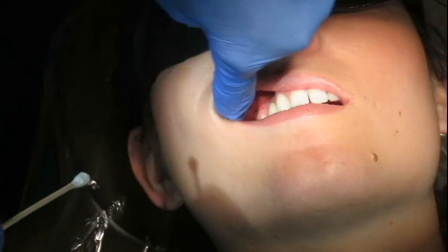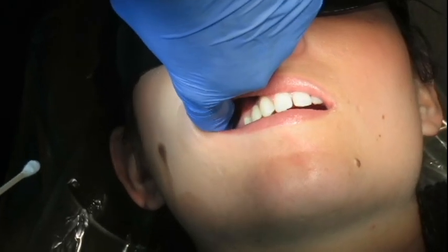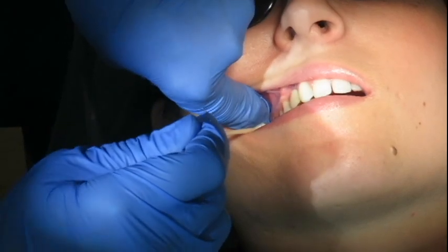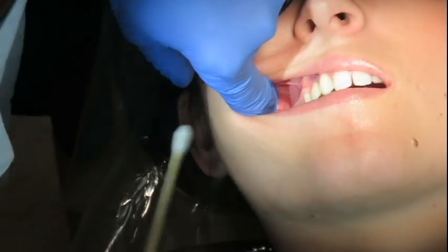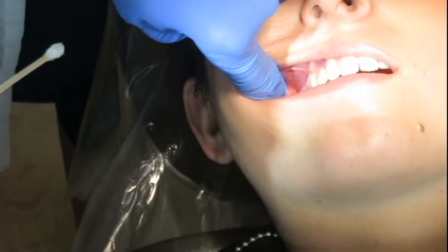So it's really important. You're going to slide back and find the zygomatic strut. The pad of your finger is going to fall into the soft spot, and your finger is kept pretty straight. Use the tip of your finger to pull up and out to find that bone. Then plant the pad of your finger on the bone so you don't slip forward.